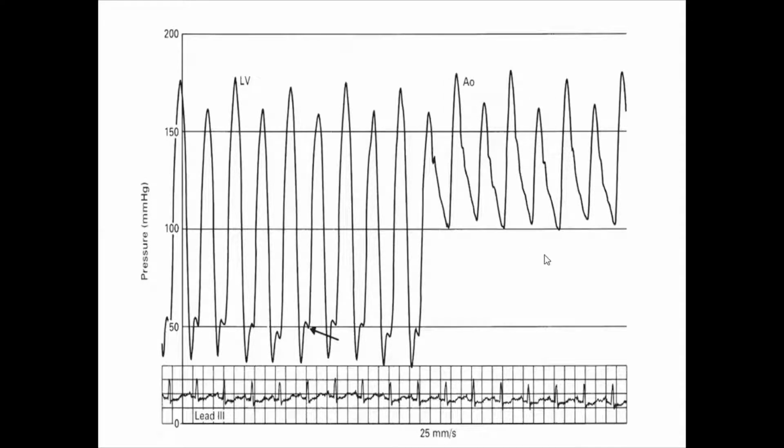What about the aorta? For the aorta, also the same. There is beat to beat variation. Also the maximum may be up to 170, 180. Systolic around 160 to 180. And diastolic aortic pressure is around 100 to 110.